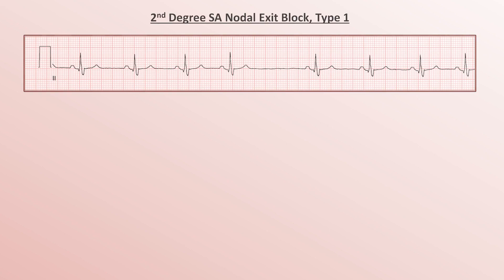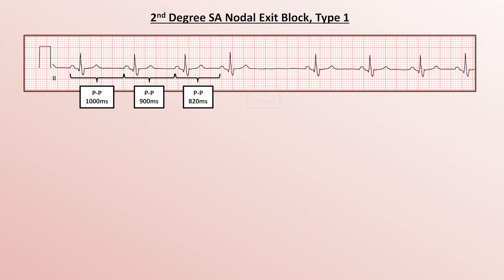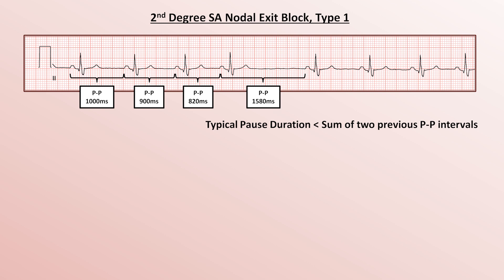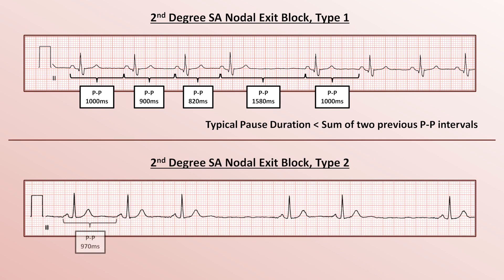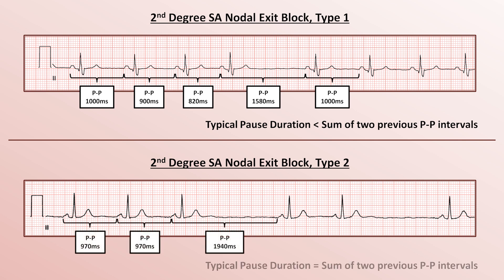Here are examples of types 1 and 2 second degree SA block. In type 1 block, the p-p interval gradually decreases until there appears to be a missing p-wave with an associated pause. The pause duration is less than the sum of the two previous p-p intervals, and the p-p interval after the pause is typically longer than the one before. In type 2 block, the p-p interval is constant until a missing p-wave associated with a pause that is exactly twice the duration of the prior p-p intervals, and the p-p interval after the pause should be the same as the one before.